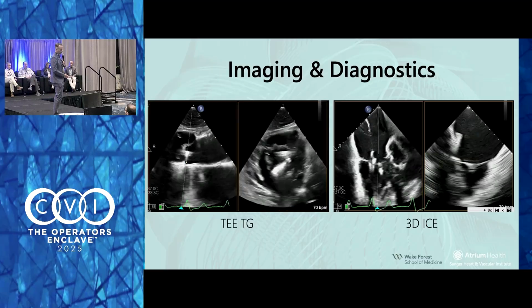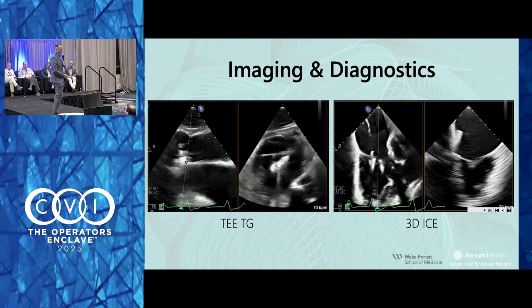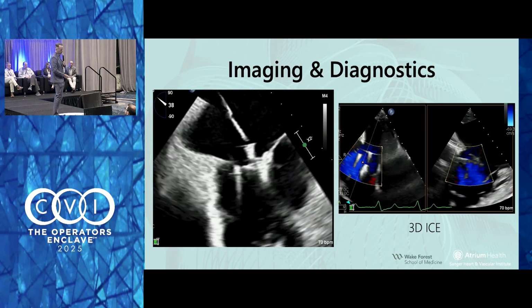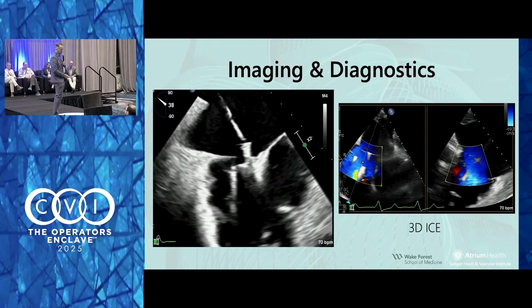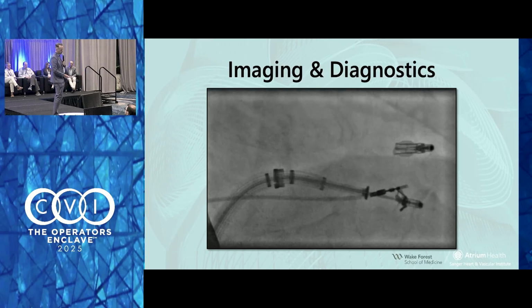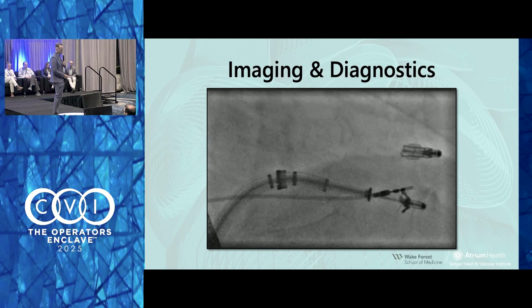Initially tried to go right next to it in the anteroseptal leaflet area. Was very difficult to see the septal leaflet falling in. We were able to get a clip in there, and it looked like there was some TR reduction, but we weren't confident that we had a good grasp of the septal leaflet, so worried a little bit about an SLDA. The big problem here was right where we needed to go. You can see the pacemaker lead is right next to it.